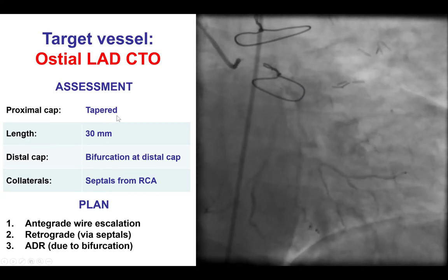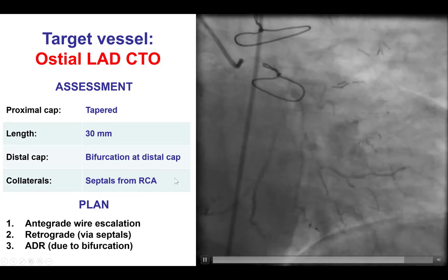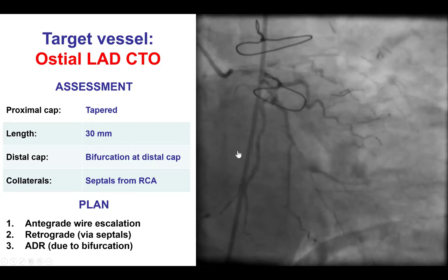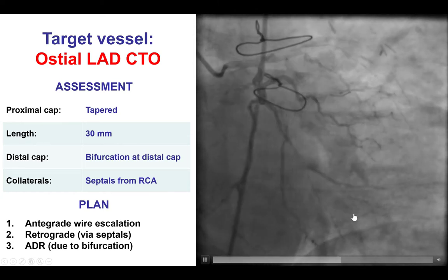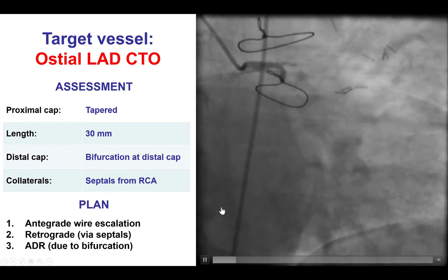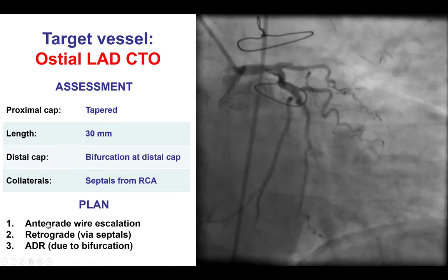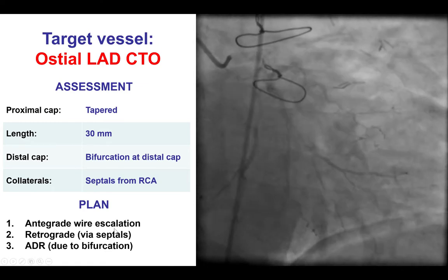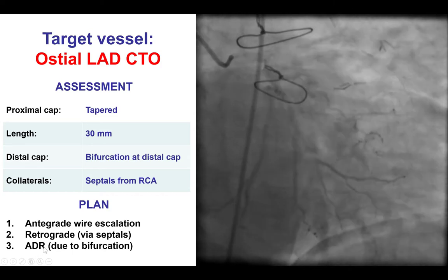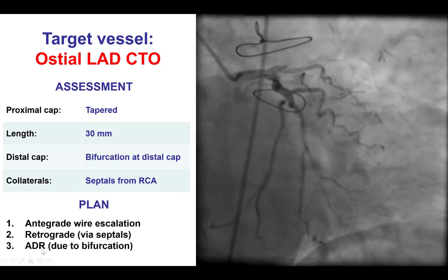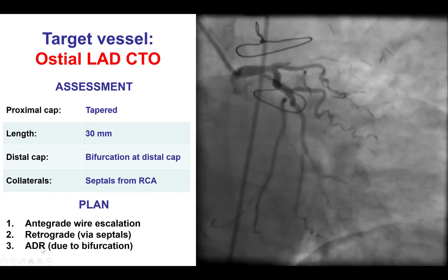On the positive side, the proximal cap was tapered. The length was not very long, about 30 mm. There was a bifurcation on the distal cap, and there were septal collaterals from the right coronary artery to the LAD and diagonal. Given the bifurcation on the distal cap, the plan was to start with antegrade wire escalation. If that didn't work, to try retrograde via septal collaterals, and leave antegrade dissection re-entry as the last option since that carries a potential risk for occluding one of the side branches.